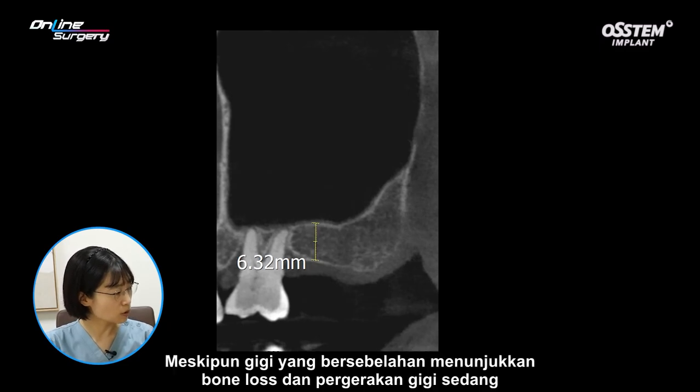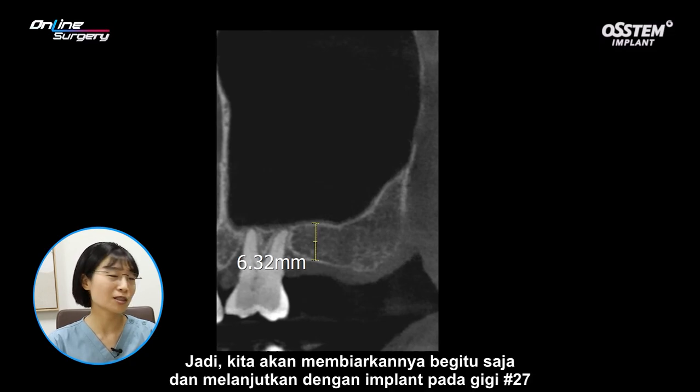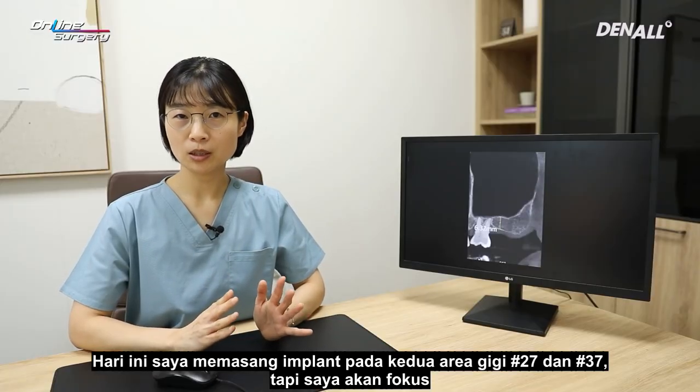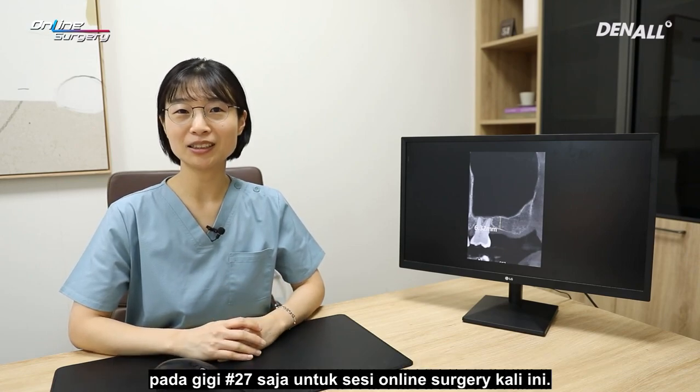Although the adjacent tooth shows some bone loss and mild mobility, the patient prefers not to have it extracted. So we will leave it as it is and proceed with implant placement for number 27. Today I have placed implants for both number 27 and 37, but today I'll focus on number 27 in this online surgery session.